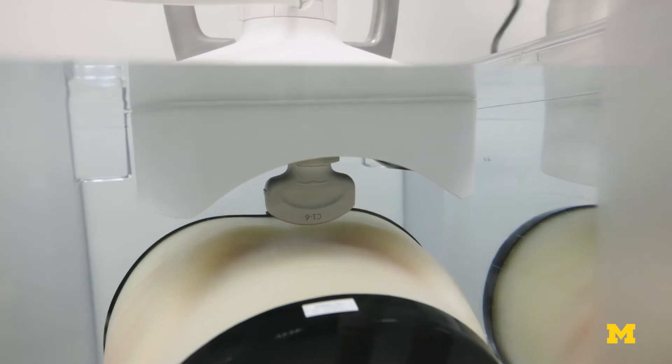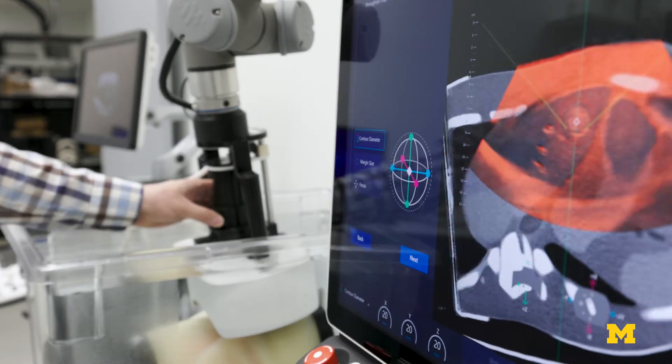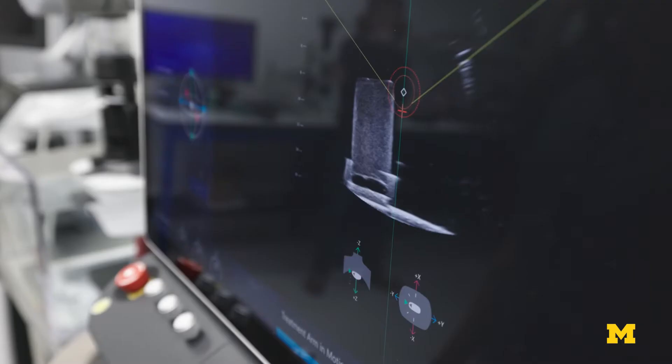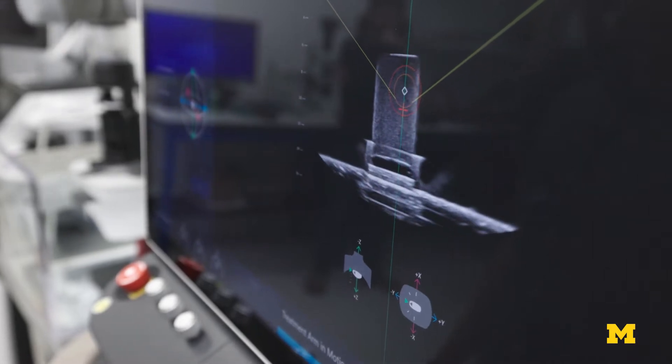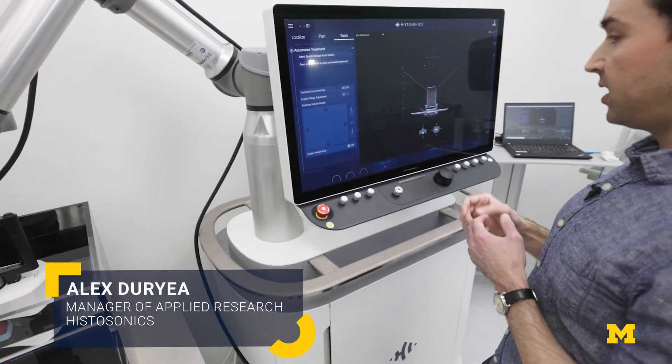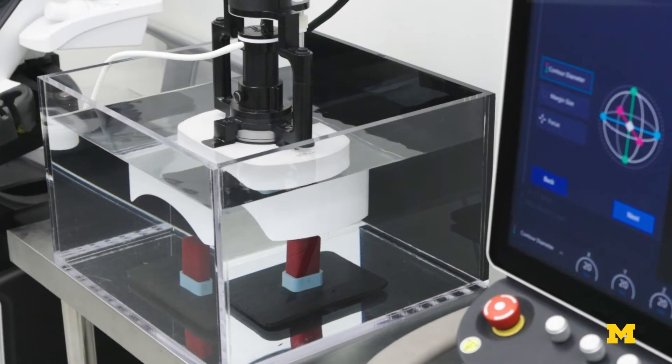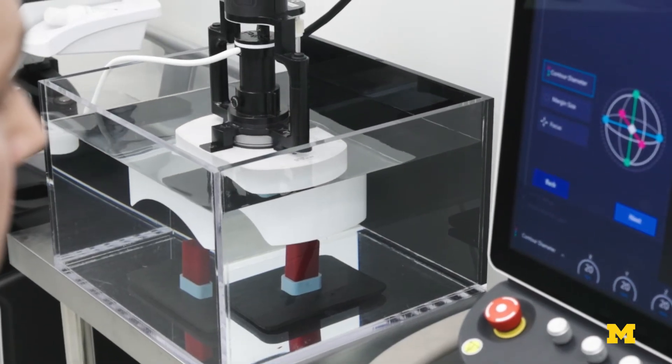We're now at the treatment stage, and everything's automated, so the user will essentially enable the treatment and then monitor in real time via the ultrasound feedback as the robot traverses our planned treatment volume.